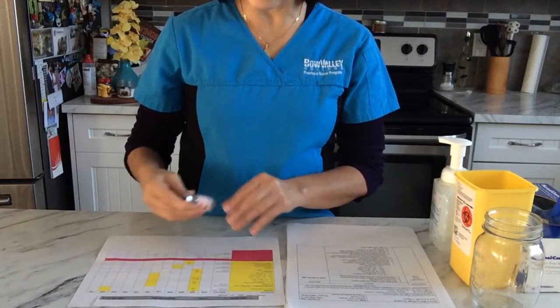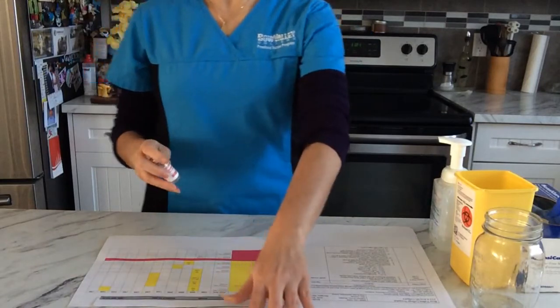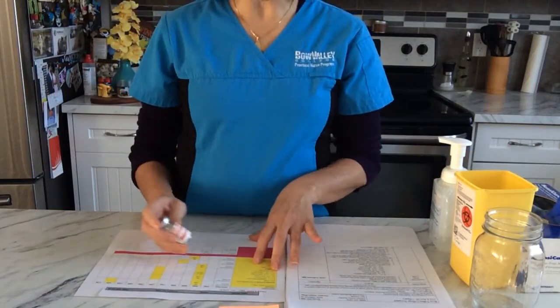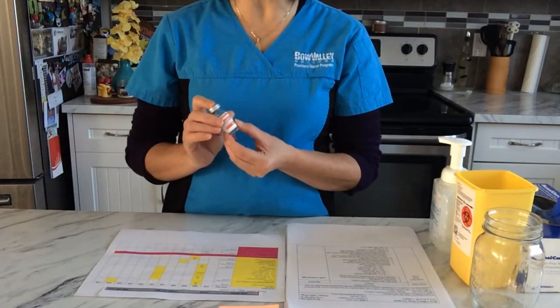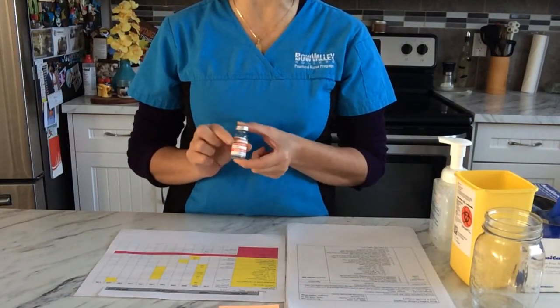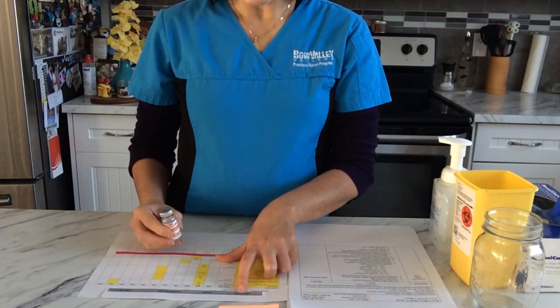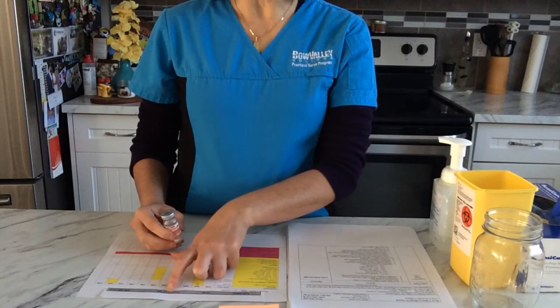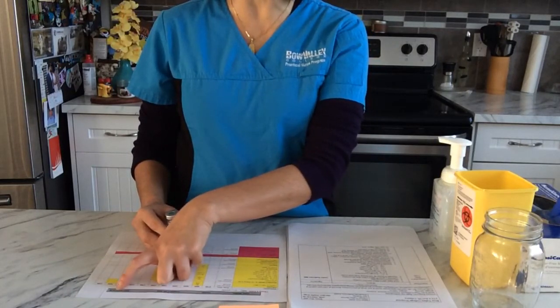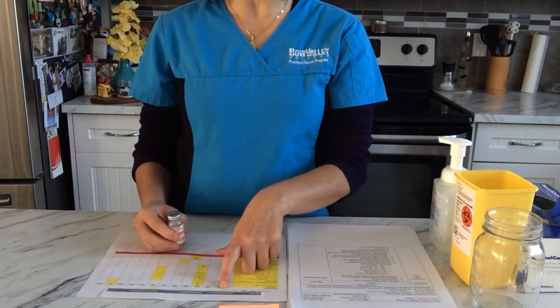So now that I have my med math done, I will do my second check. This is a practice vial, it doesn't have any information about my patient. So this is for Parks Marta, female, hospital ID 121-2392, date of birth 1956, February 20, today's date December 1st, 2020.